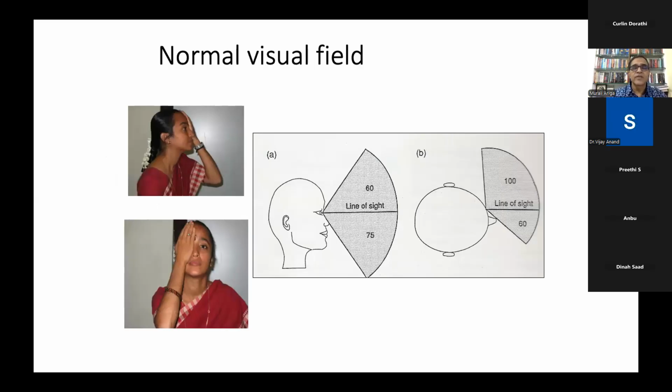So we all know the extent of the visual field, and this is for the students, for completeness sake, that we really need to understand the extent of the visual field. One eye has to be covered, you fixate and you look around, and what you see above, below, and left and to the right, temporal, nasal side. Obviously, we're limited by the field because of the nose and the bridge of the nose on the nasal side. And the widest field of vision lies to our temporal side.